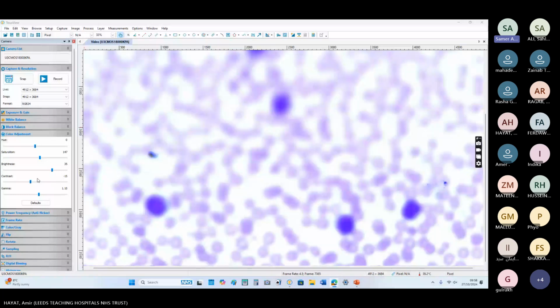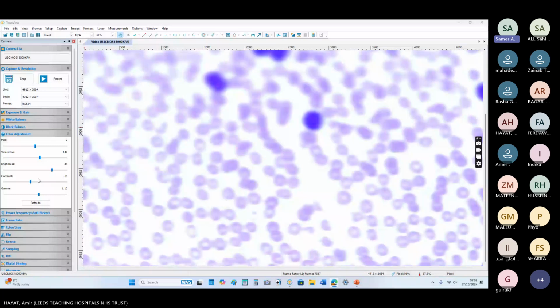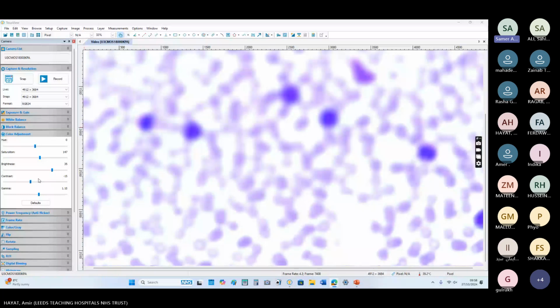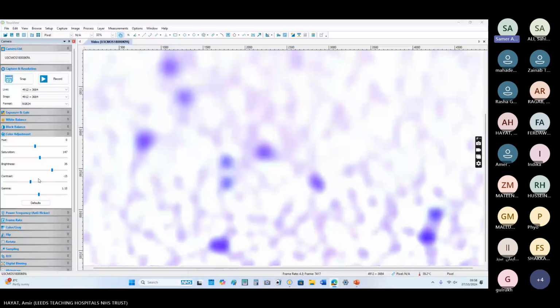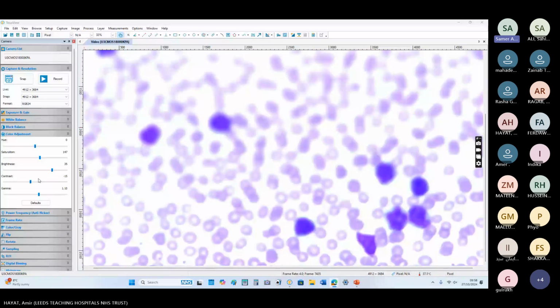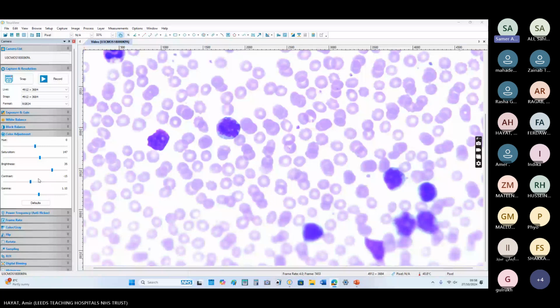So some of these cells look like a CLL sort of morphology, plus the smear cells that support that, but I'm not quite sure, because some cells are a bit larger in size, and this prominent nucleolus makes me a bit confused about the possibility of some malignant transformation.